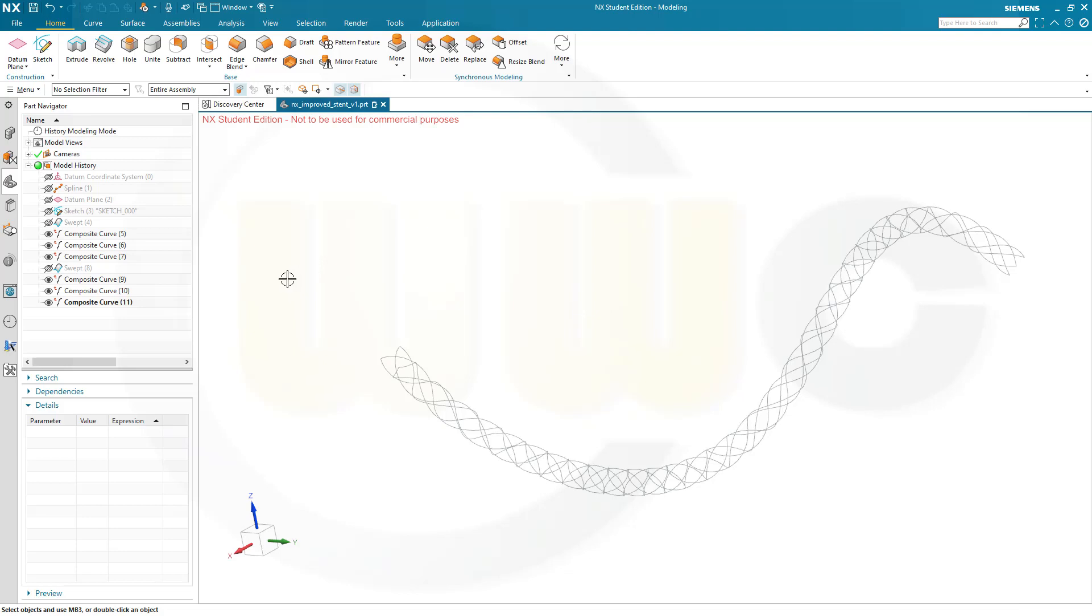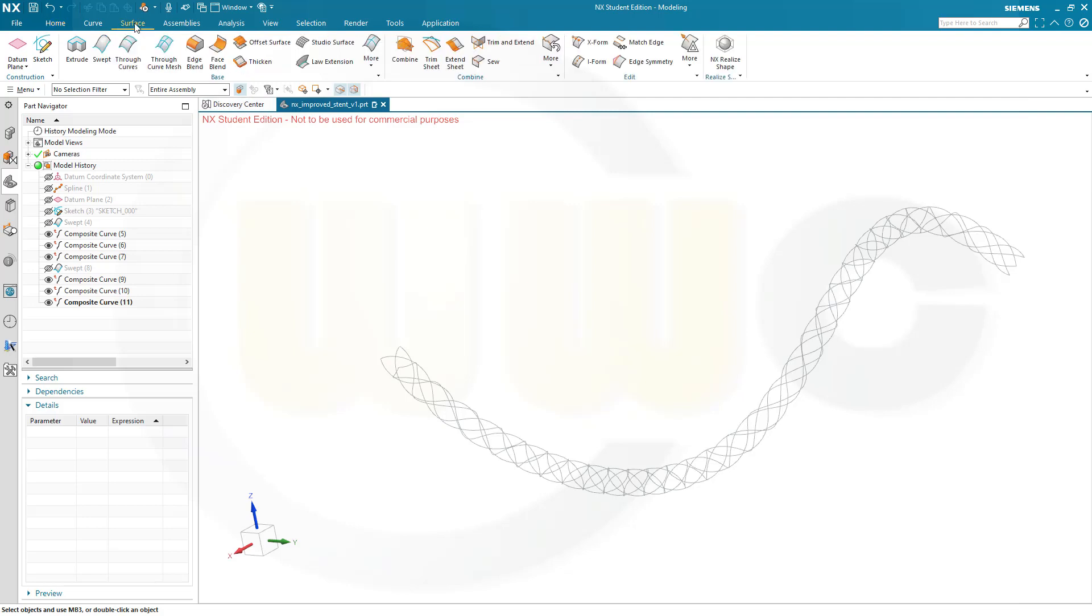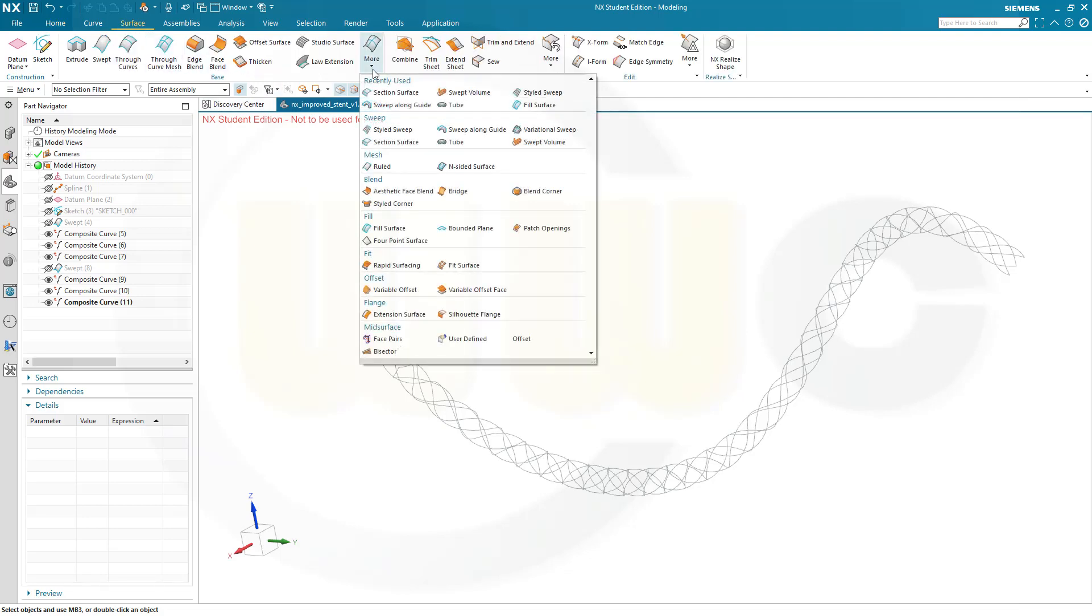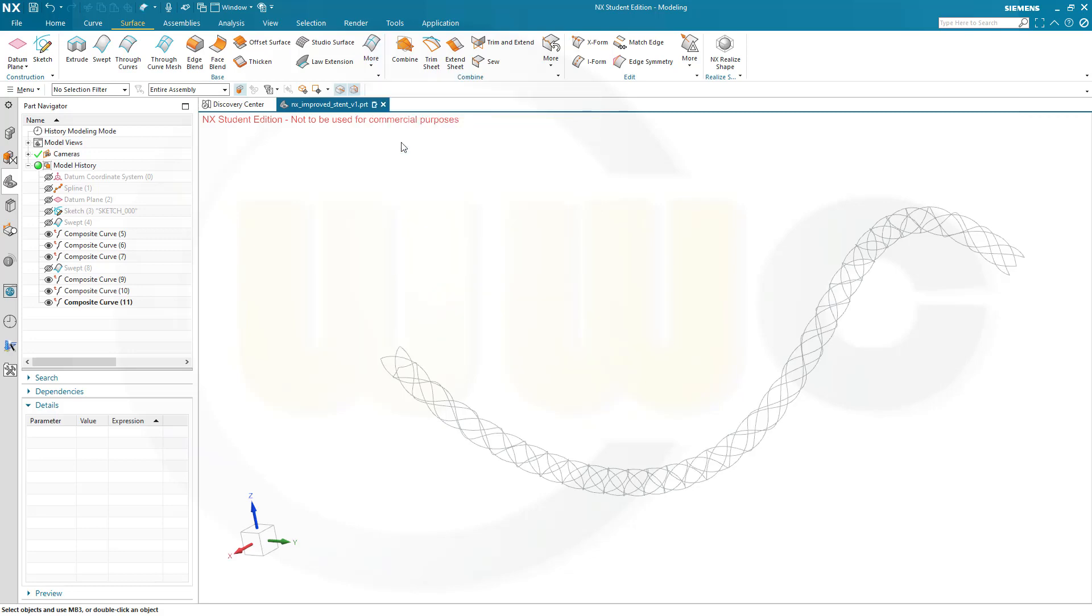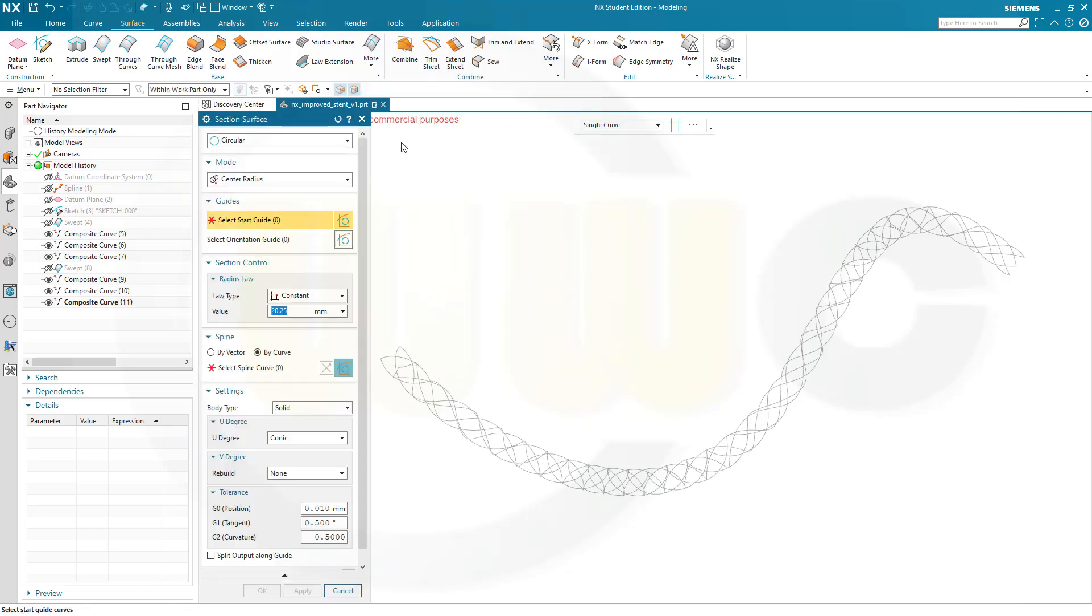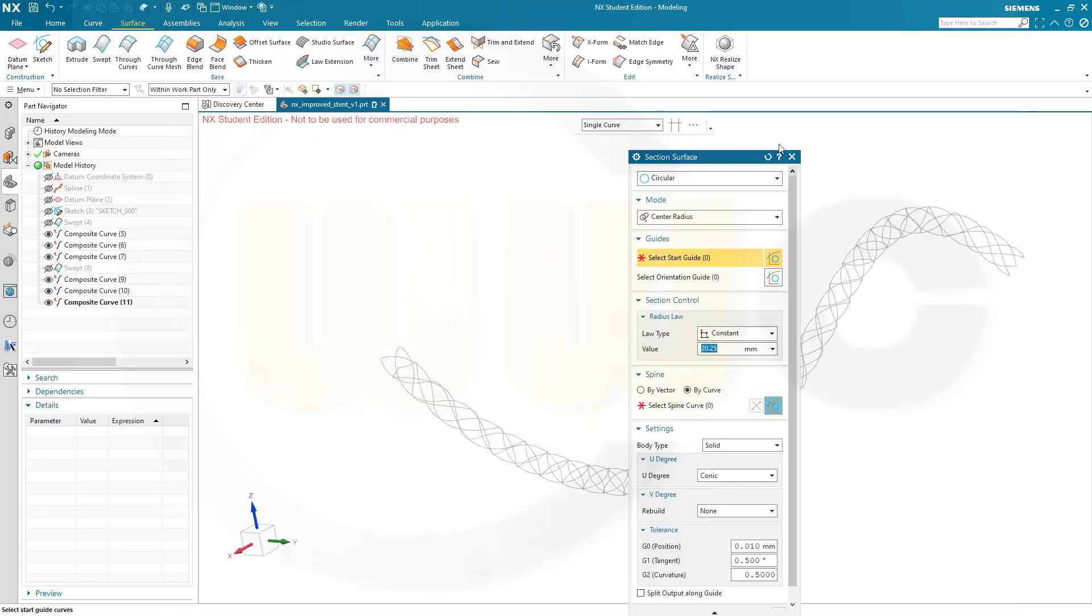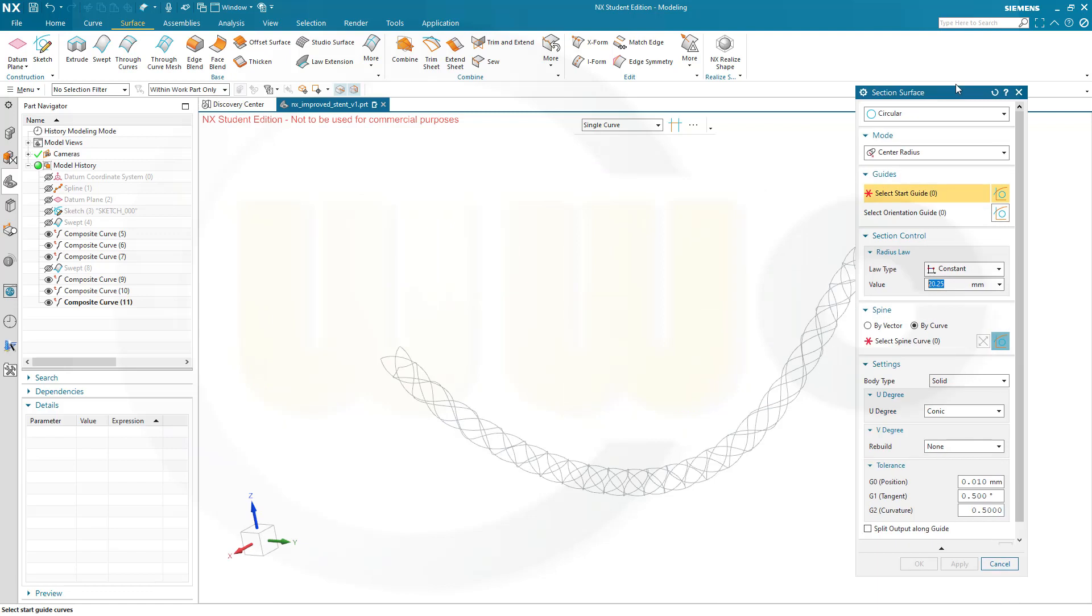And that's where we can start to do the section surfaces. Let's go to Surface, go to More, go to Section Surface, and select a circular one.